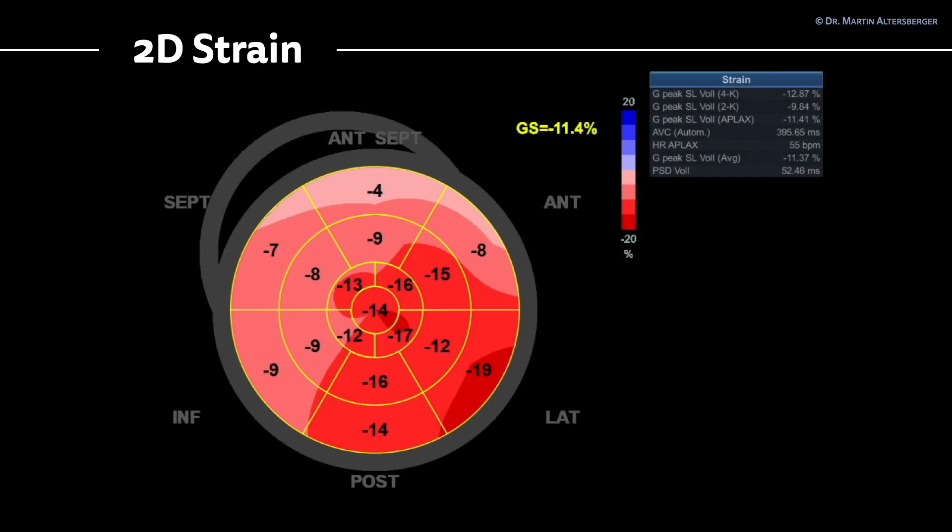This is now the global longitudinal strain of all three views: the four-chamber view, the two-chamber view, and the apical long axis view. Overall, the global longitudinal peak systolic strain is in the range of minus 11.4 percent — markedly reduced.